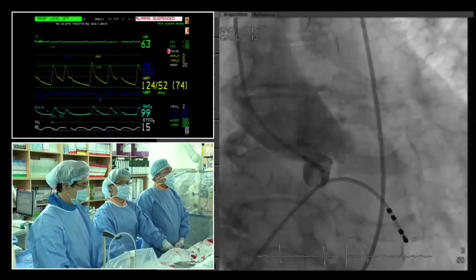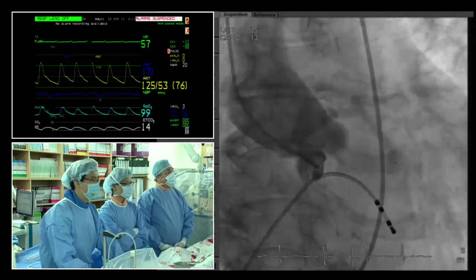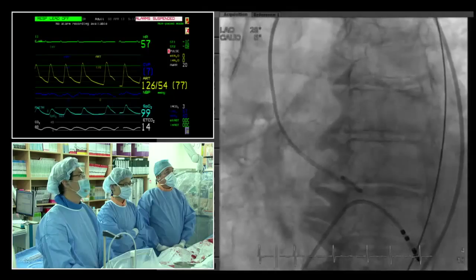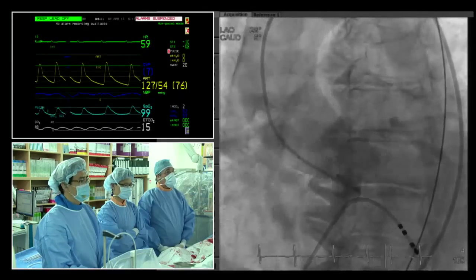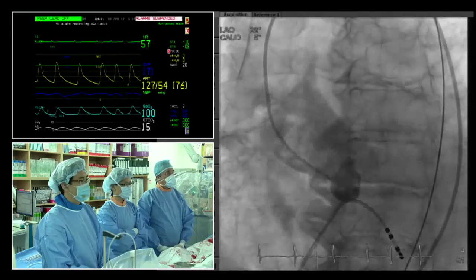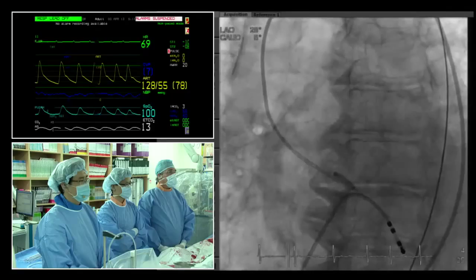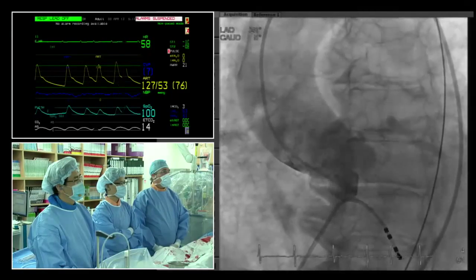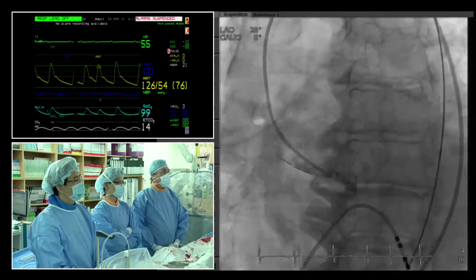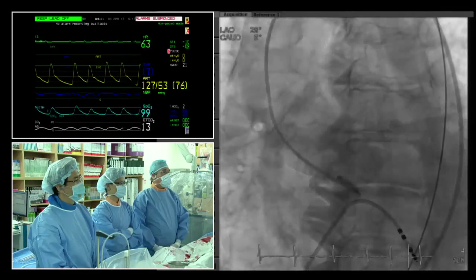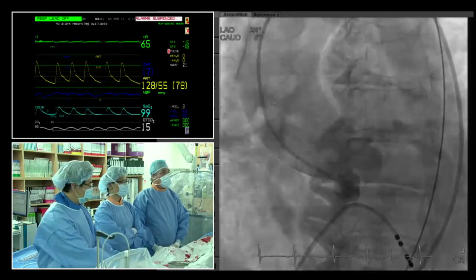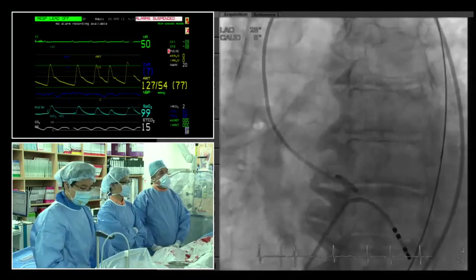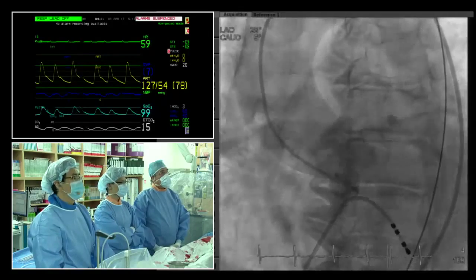Panel input: Paul agrees that choosing a 26 is better than a 23 in this case because the ascending aorta is large, and with the 26 you can implant the valve a bit lower, giving more space between the valve frame and the left main and right coronary ostium. Michael raises a question about whether the anomalous right coronary takeoff is a concern with the CoreValve.